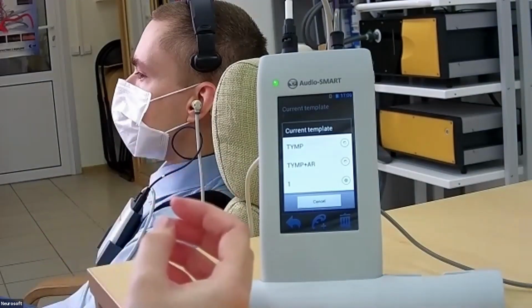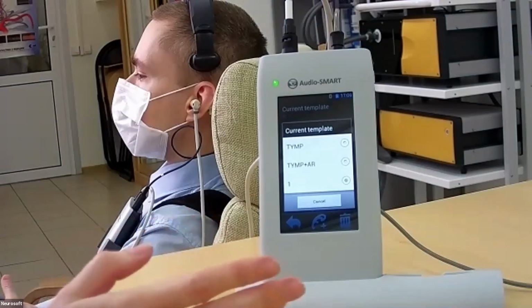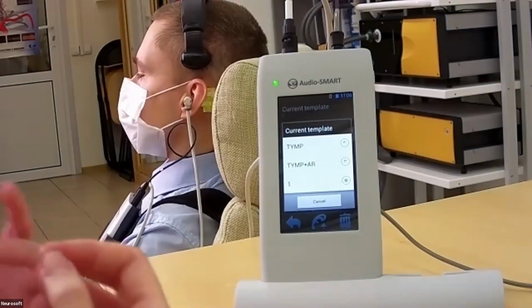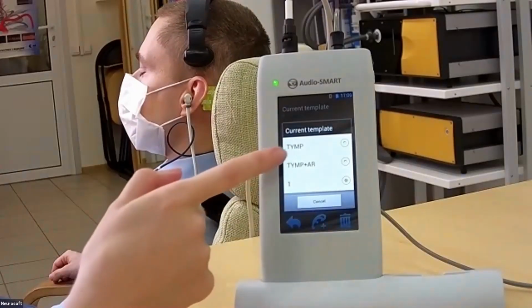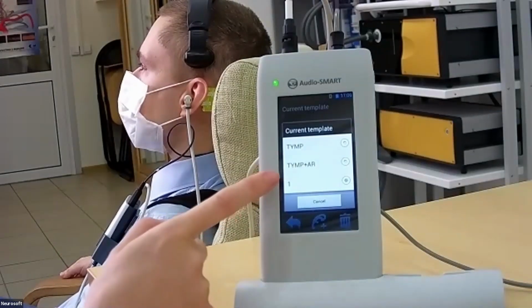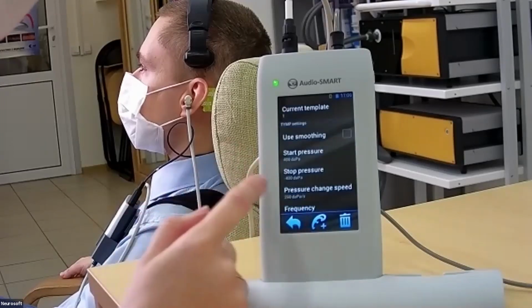It means that when you finish the tympanometry, you will have an opportunity to go to the acoustic reflex in this test window, and you don't need to go to the main menu. In these cases, you choose this template. And also you can create your own template and name it, as I have done.